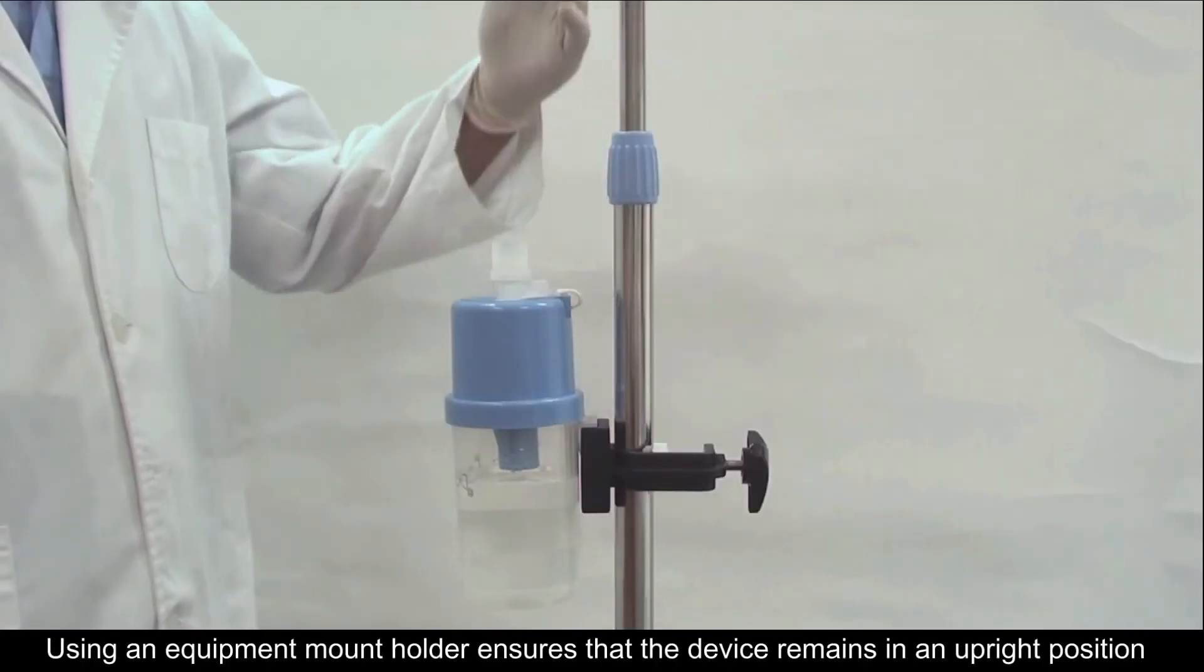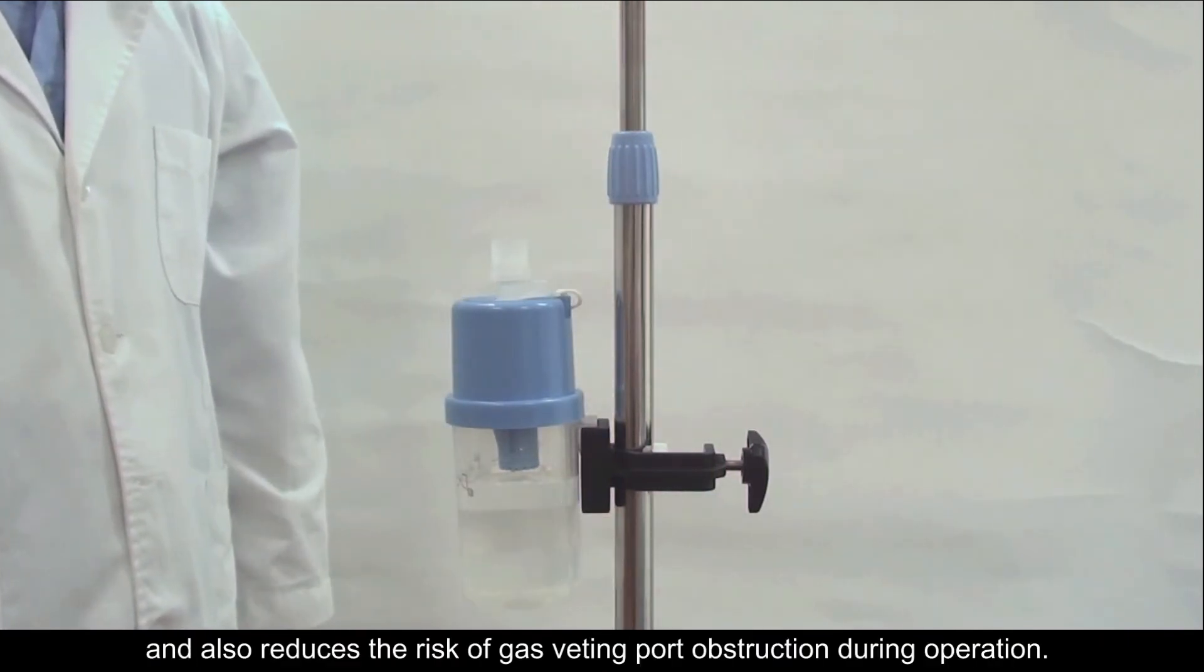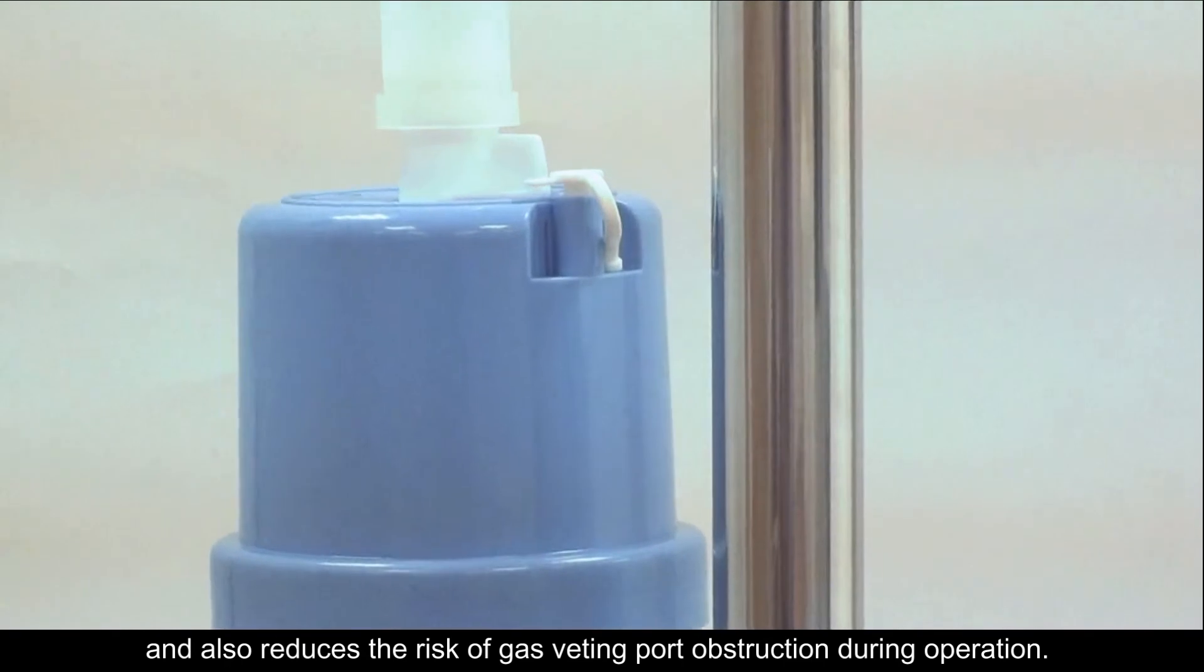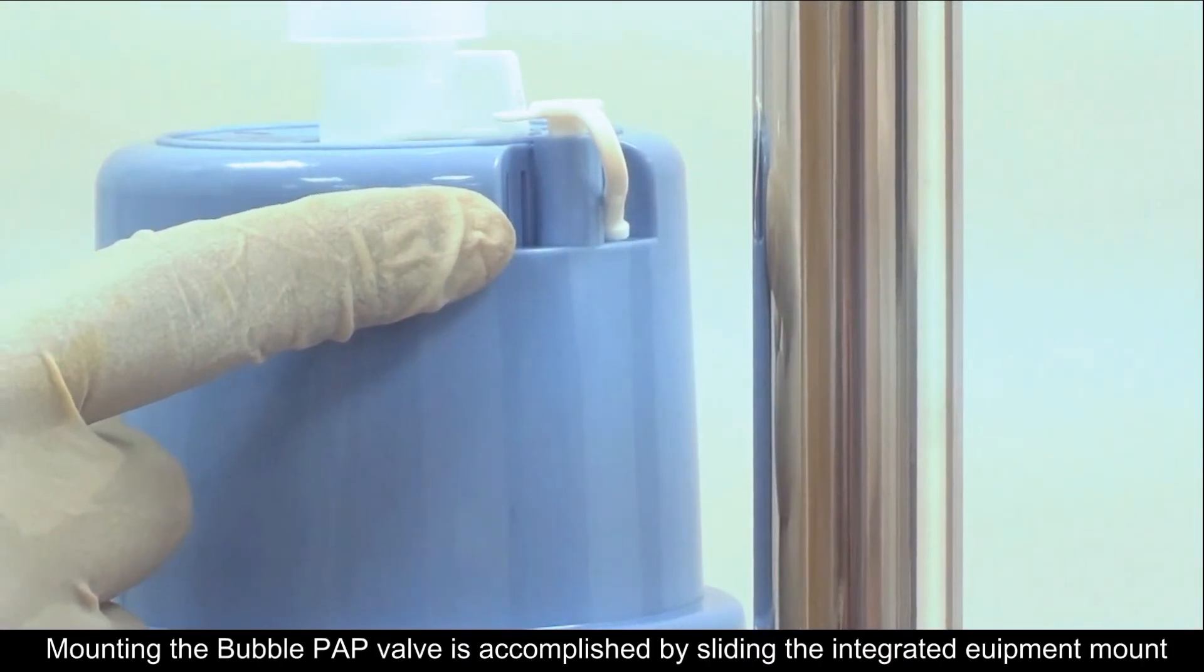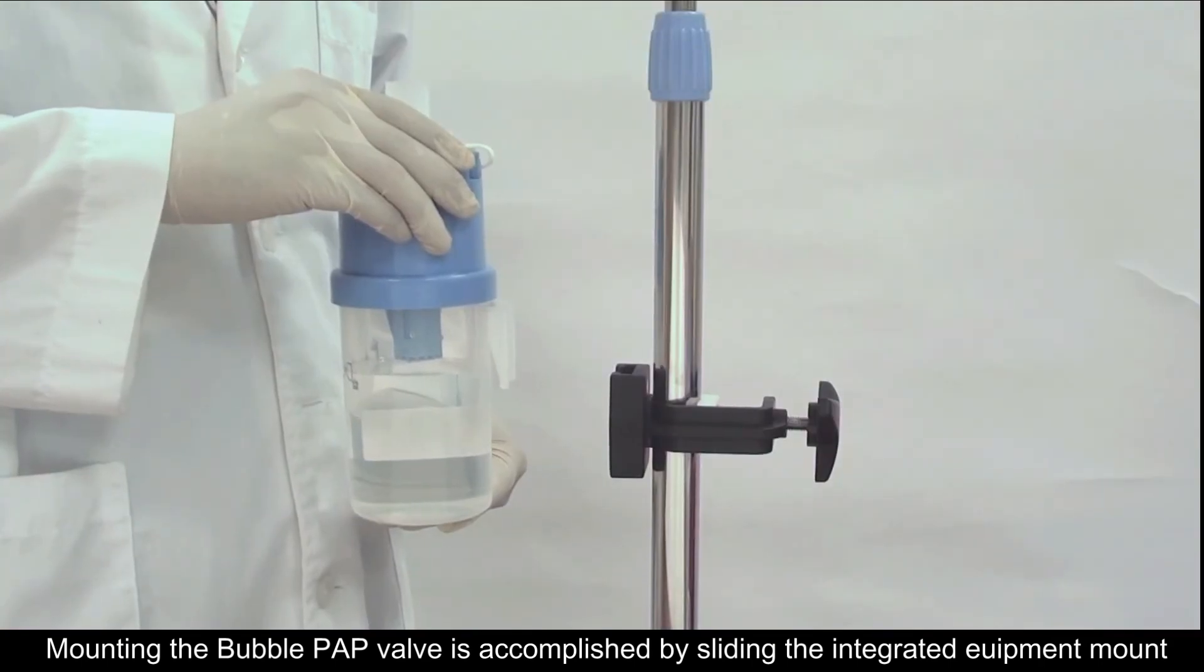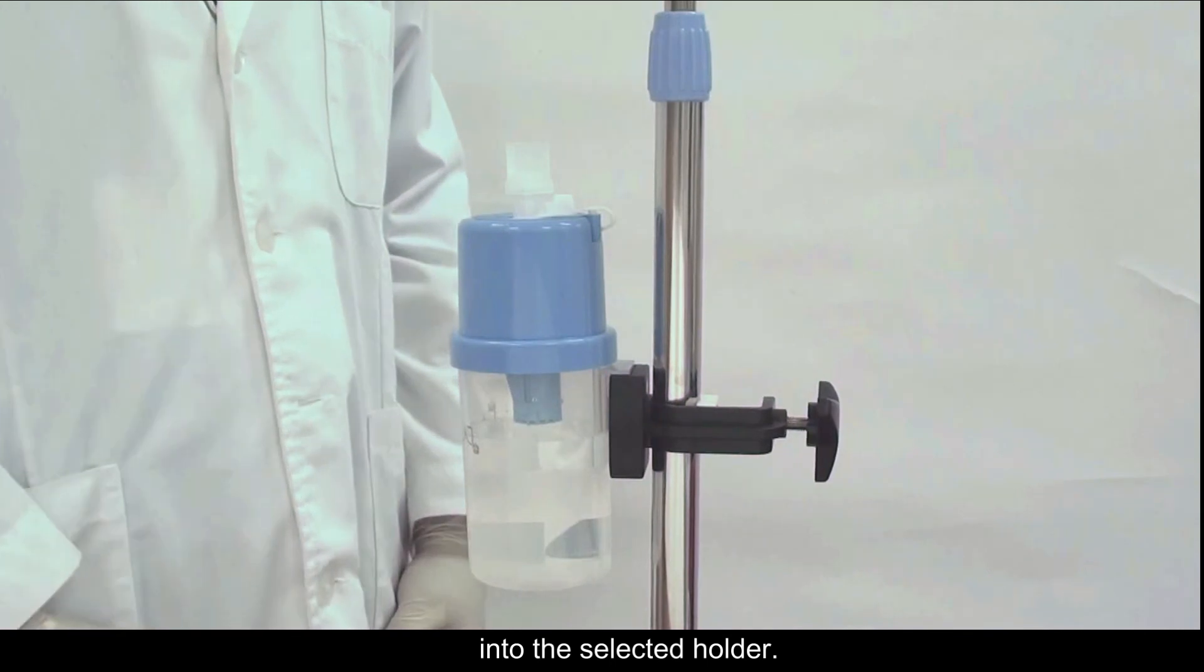Using an equipment mount holder assures that the device will remain in an upright position and also reduces the risk of gas venting port obstruction during operation. Mounting the Bubble PAP valve is accomplished by sliding the integrated equipment mount into the selected holder.